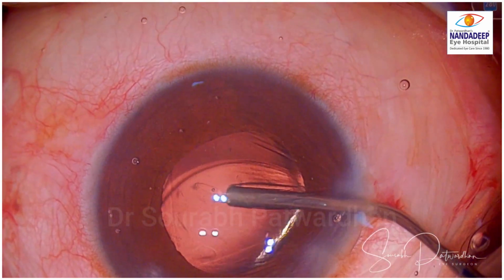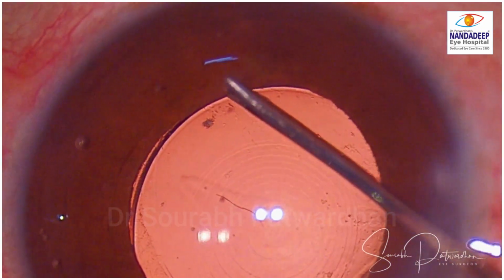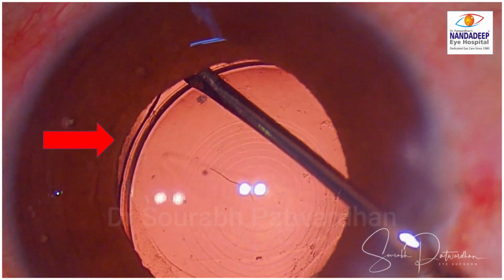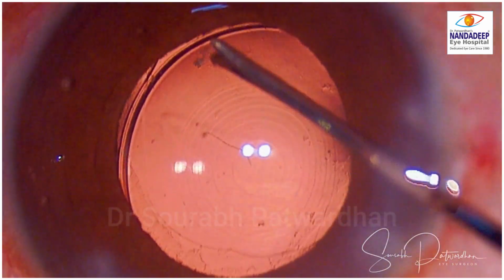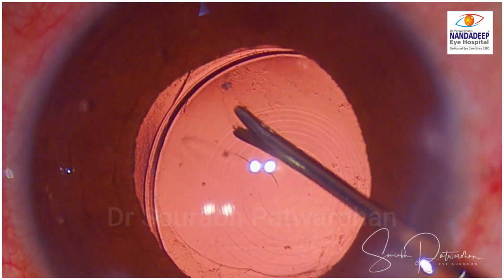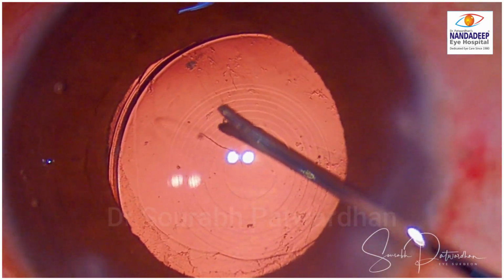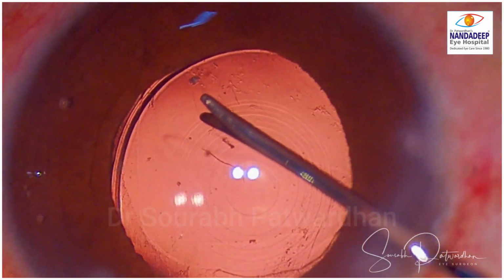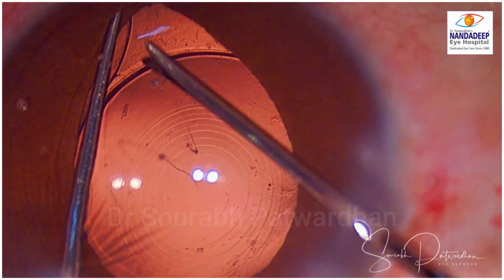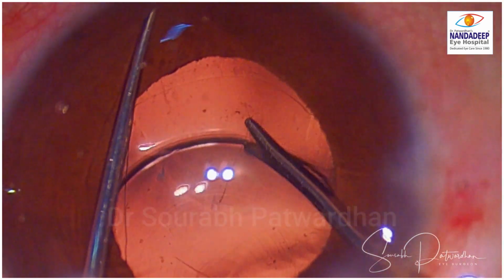Still I have a little bit of doubt, because if it is already in the bag and I am pushing the IOL down, I may cause zonular loss. So I rechecked using the Y pusher. Just retract the iris to one side and check for the CCC margin there. Because the CCC and IOL are very close, sometimes even with good stereopsis there will be a little bit of confusion.